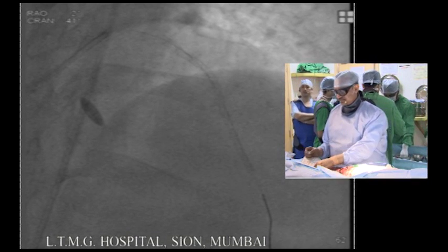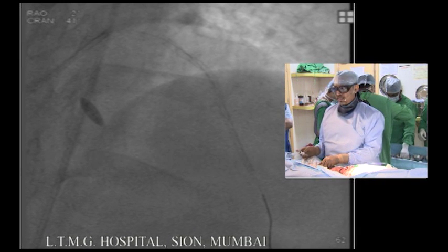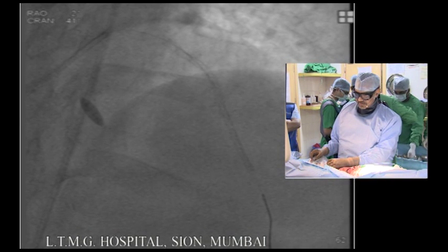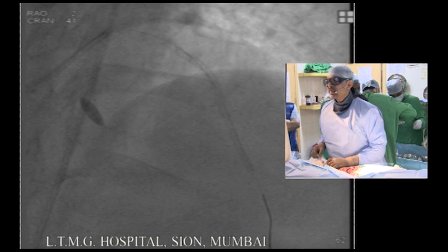First, zero. How about the patient, please? Patient is comfortable. The pressure is slightly less. It is in the range of 80s. ECG is normal.